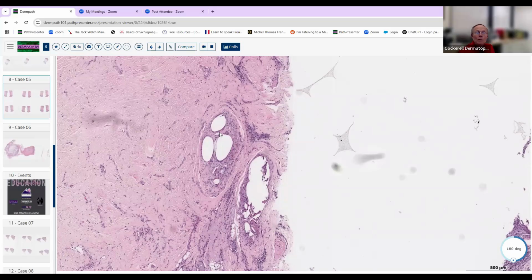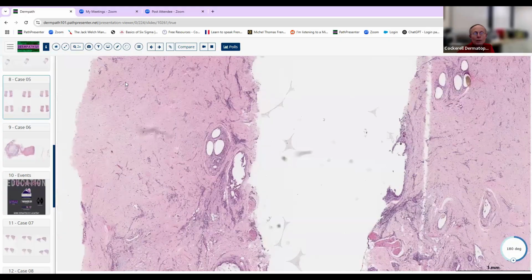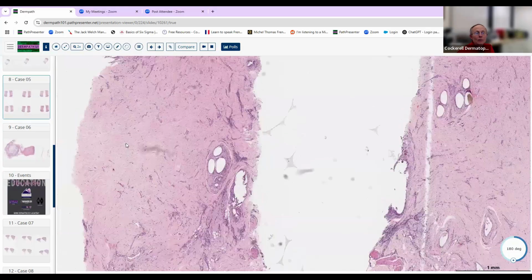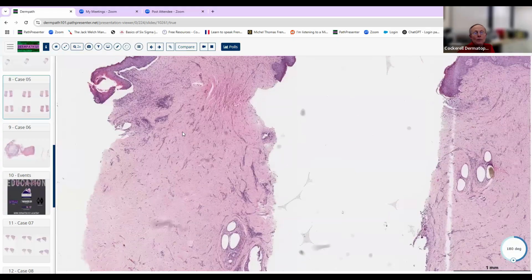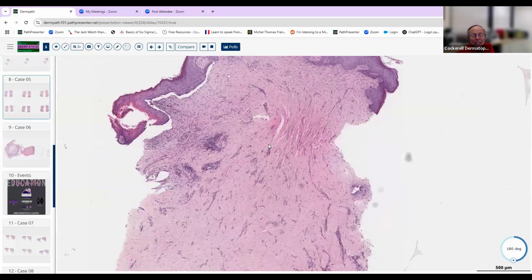So it's possible that this was an example of LPP or CCCA, where you got a severe form with secondary rupture and scar that then just kind of progressed out diffusely through the dermis here. Now, if you just saw this up here with scar, that's just totally late stage scar, I would actually favor something like folliculitis decalvans, that we were at a very late stage of that with residual scar with really minimal inflammation. Normally, we'd like to see neutrophils and some suppuration, but we don't see any of that here.